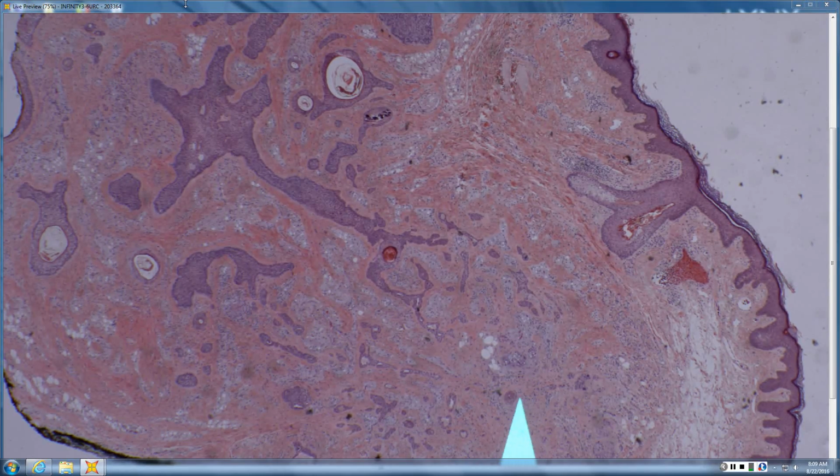right? Even from scan, you see fat, you see a branching alveolar pattern. But then in the center here, you have a mama follicle and baby follicles hanging off of mama follicle. So what do you have? Trichofolliculoma. Yeah, so you've got areas that are trichofolliculoma, or at least fibrofolliculoma with strands. I'm not sure that they're really forming hairs or full baby follicles, but something between a fibrofolliculoma or a trichofolliculoma embedded in or part of a mixed tumor.